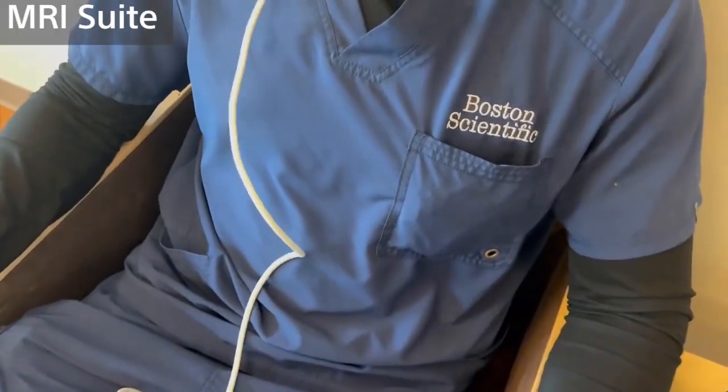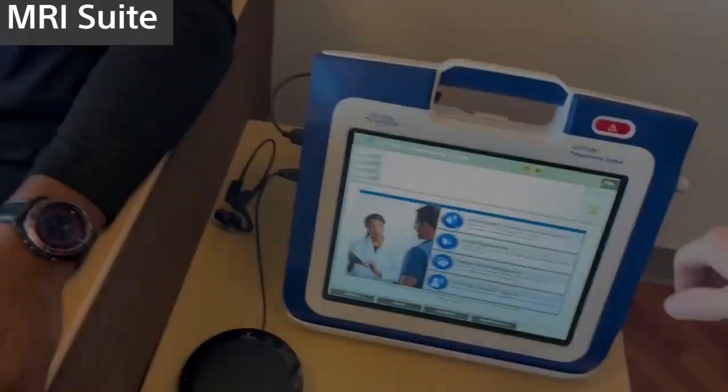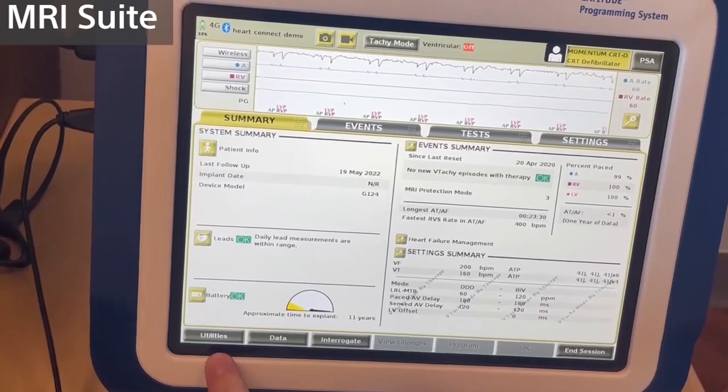Now before we can use HeartConnect, we first have to interrogate the patient's device. We do this by placing the wand over the patient's device and selecting Quick Start. Once your pacemaker or ICD has been interrogated, it'll take you to the summary screen.